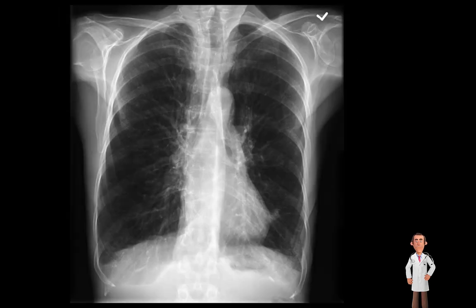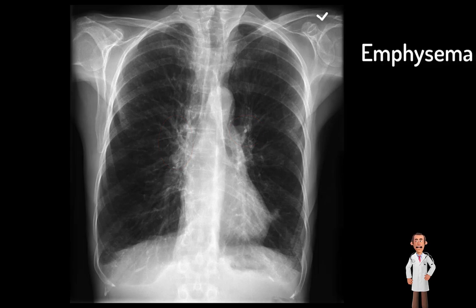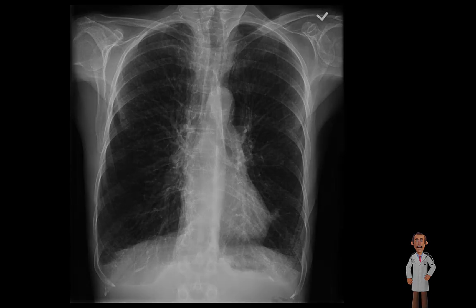Case eight. This chest radiograph demonstrates marked hyperinflation of both lungs. We can see over 11 posterior ribs. The diaphragms are flattened, there is enlargement of the retrosternal airspace, and some prominence of the pulmonary arteries. The most likely diagnosis is emphysema — most likely centrilobular, due to smoking. There are various types of emphysema: centrilobular (the most common), panlobular, paraseptal, and paracicatricial. The prominence of the pulmonary arteries suggests a degree of pulmonary arterial hypertension. In summary, there is unequivocal evidence of marked hyperinflation secondary to emphysema.